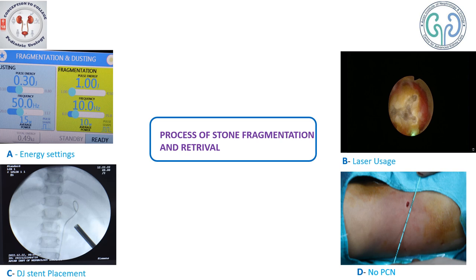The process of stone fragmentation begins, for which we have used a thulium fiber laser with energy settings of 1 Joule and frequency of 10 Hertz. Using a 12 French nephroscope with the thulium fiber laser, this is how the stone is fragmented. Using triforce forceps, the stone is retrieved for stone analysis.